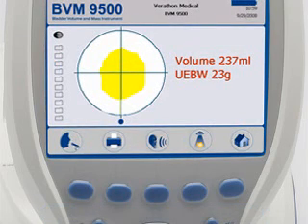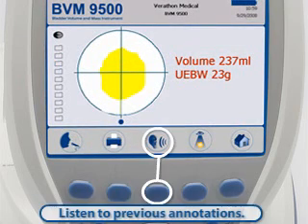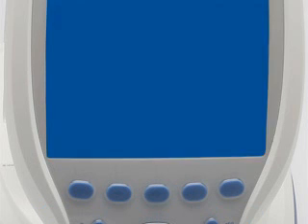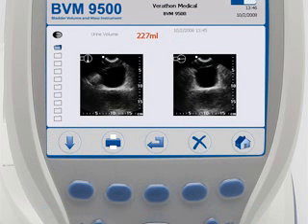After you have saved the exam, you may listen to previously recorded annotations or review data from saved exams. The BladderScan BVM9500 has two review screens. Review Screen 1 shows bladder volume measurement results.